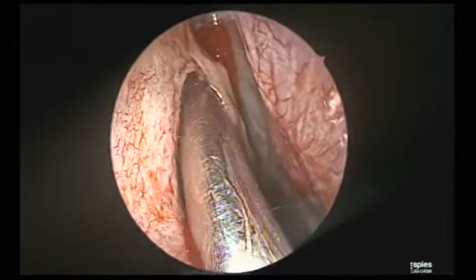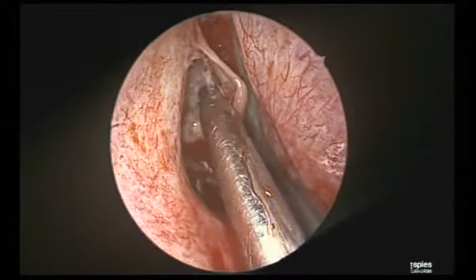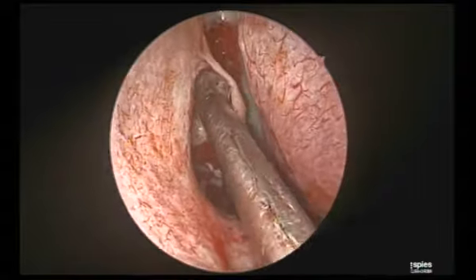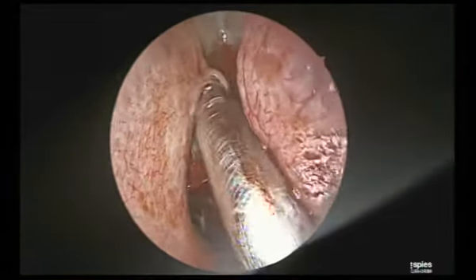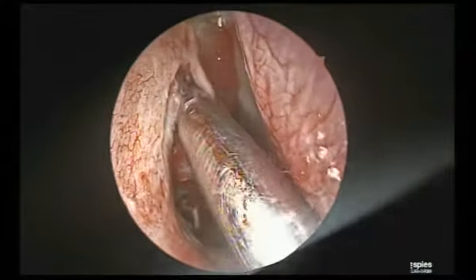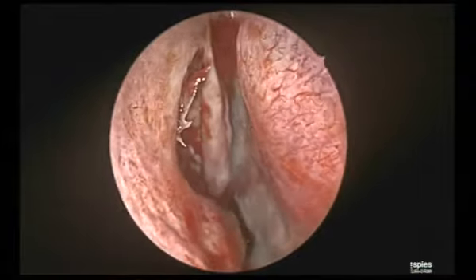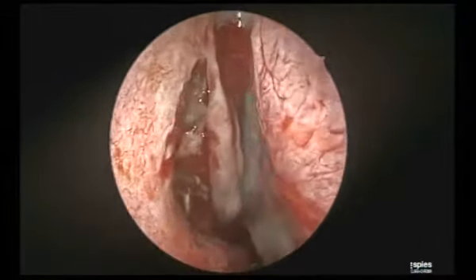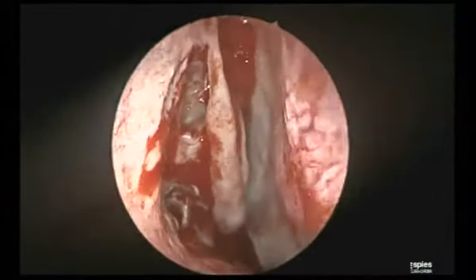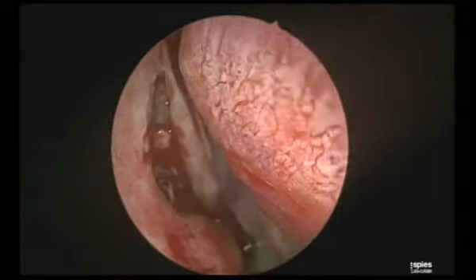So go till it debrides to the axilla. See this? Under vision, I will go to the axilla. I will never do anything to the axilla which can damage it. I really respect the axilla, because if it drags the turbinate laterally, it closes everything. The medial half of the axilla should be worshipped, not invaded.